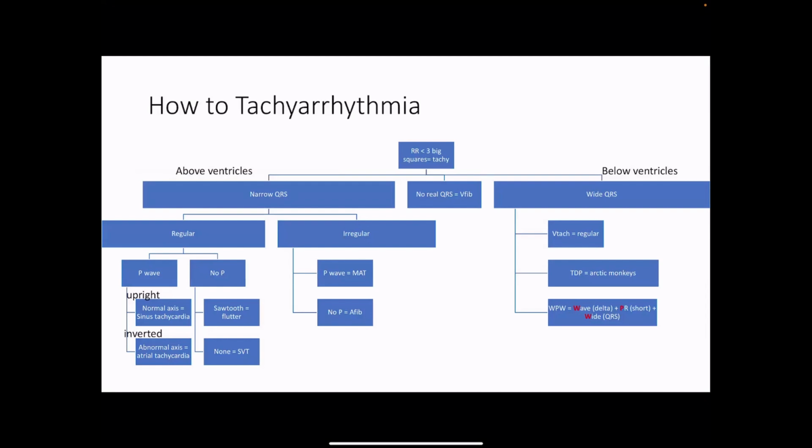Now, this diagram is what saved me through studying tachyarrhythmias. It has everything you need to know, everything that makes you read ECGs like a breeze. So helpful. And this one is not in your lectures, right? The table? Yeah, no, it wasn't in the lecture. Yeah, so this table is from Rafi. He gave us a session last year, and it's an amazing table, so thanks to him.